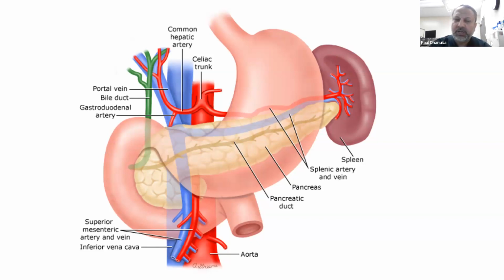It's very difficult to biopsy the tumors in this area, including the lymph nodes or the pancreas tumors or the bile duct tumors, with an external biopsy like radiology-guided, CT-guided biopsies, because it's so much in the center of the body as well as surrounded by so many blood vessels, it can be dangerous. And that's one of the reasons pancreas carcinoma is extremely difficult to diagnose, and we will talk more about it. And that's where EUS has very, very handy access.